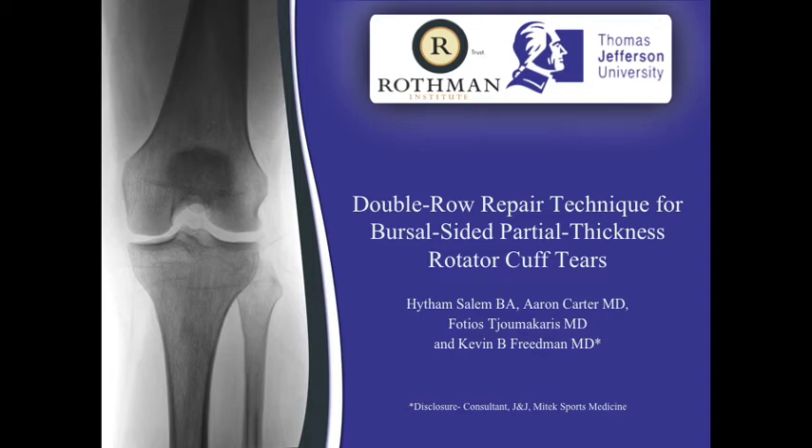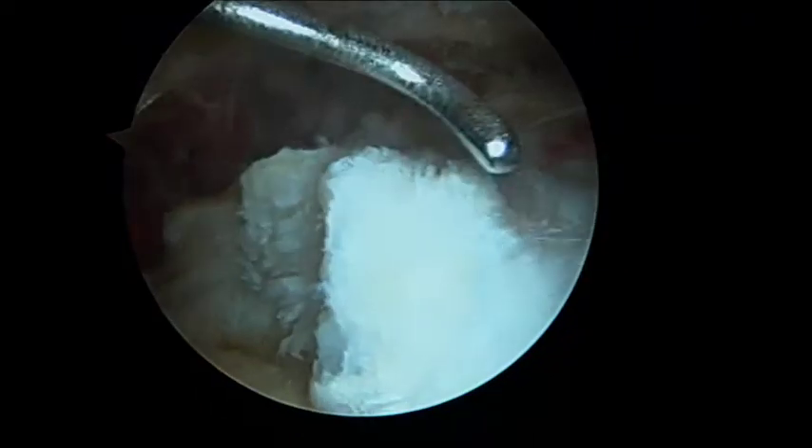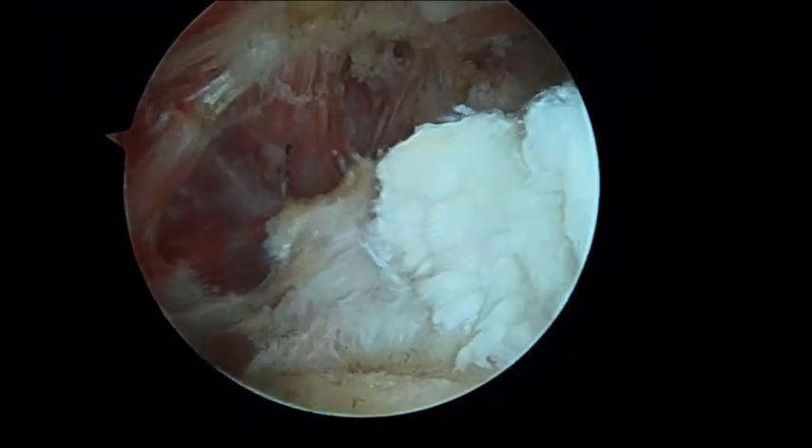Double Row Repair Technique for Bursal-Sided Partial Thickness Rotator Cuff Tears. Once the bursal-sided cuff tear is identified, the footprint of the rotator cuff is then carefully debrided to avoid any damage to the intact fibers of the cuff insertion.